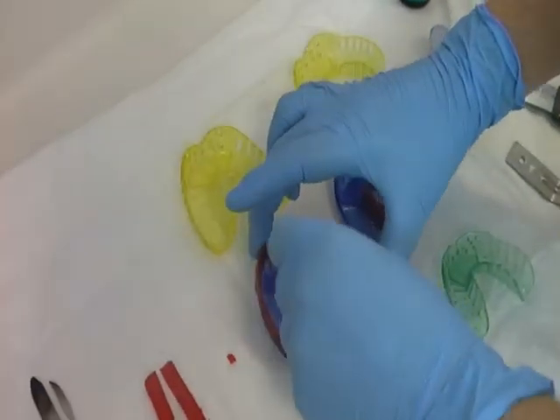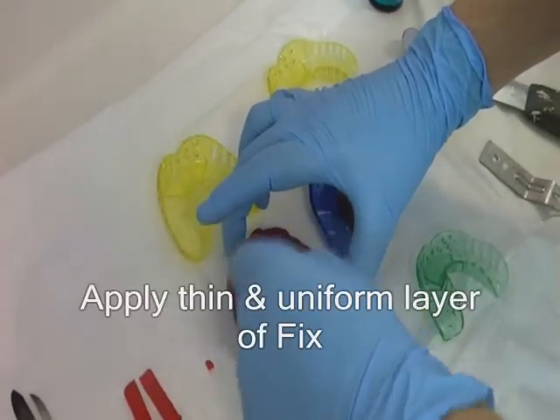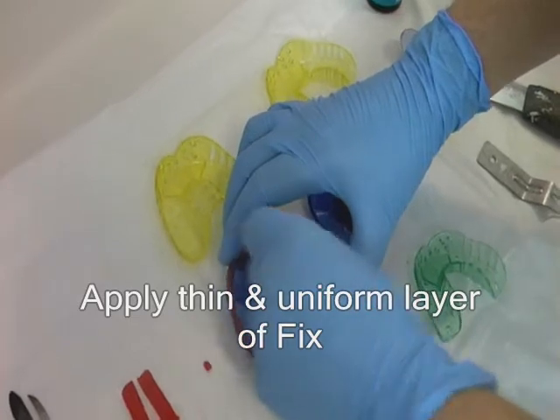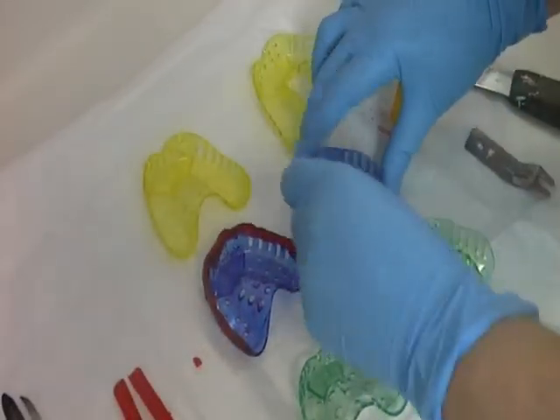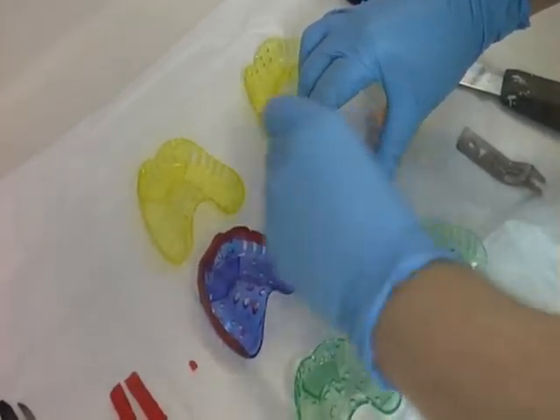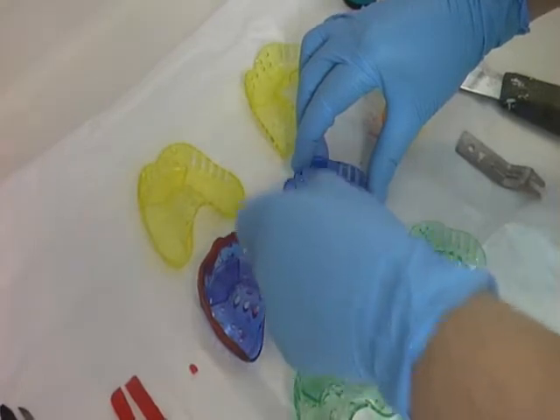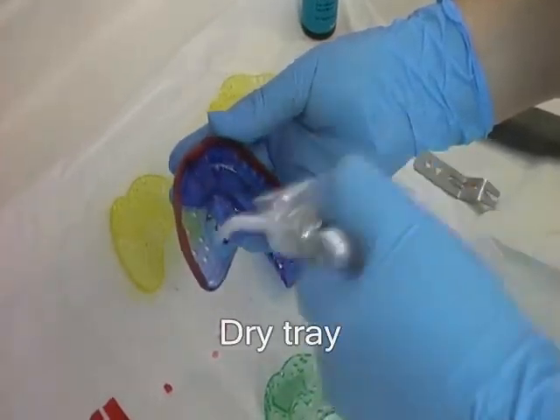Tray adhesive called fix is used to increase the adhesion between the impression material and the impression tray. Using a small brush, apply a thin uniform layer of fix to both the upper and lower trays. It is important to avoid applying too much tray adhesive. Use the compressed air from the 3-in-1 tip to dry the tray as demonstrated.